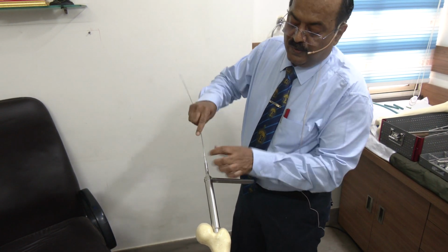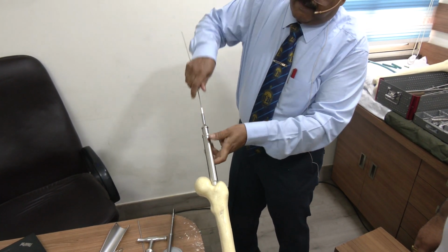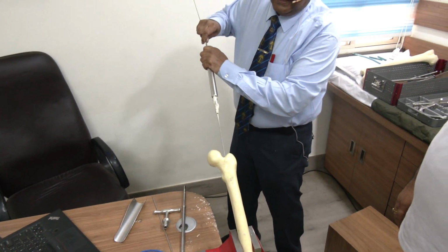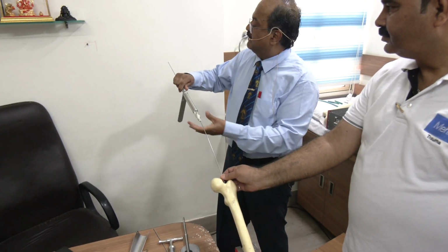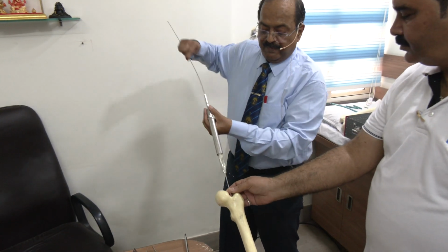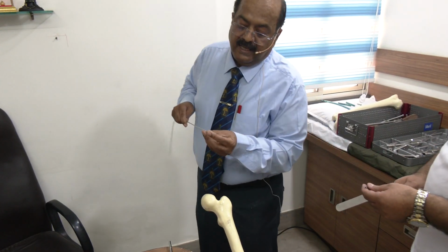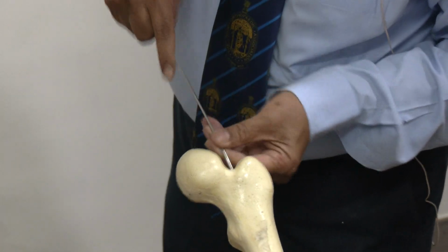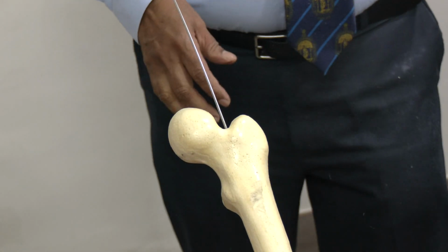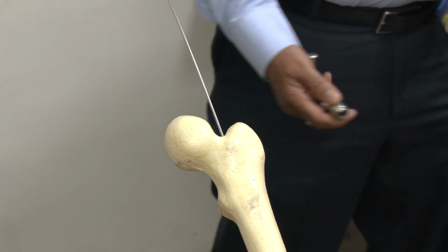Okay? So that helps in reaming if it is required, and also in passing the nail. Now the work of the protector sleeve as well as the reamer is over. So we take this out, and a beaded guide wire also can be passed by exchange tube, and that will help in using the reamers. Flexible reamers are available with the set.